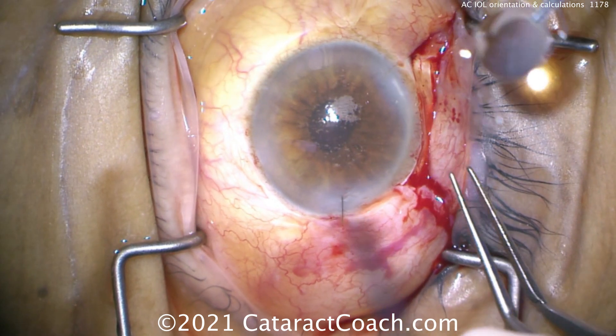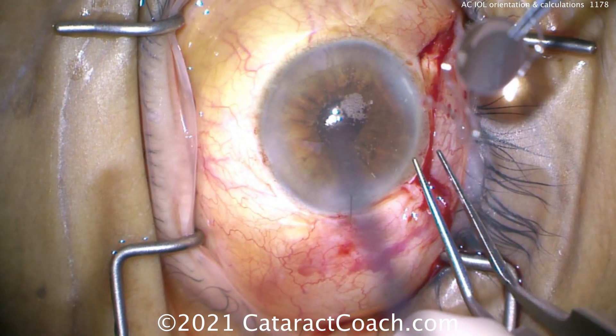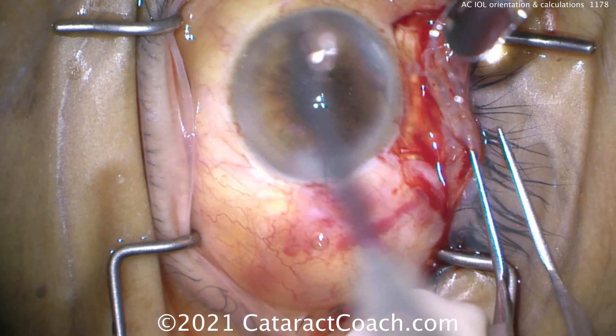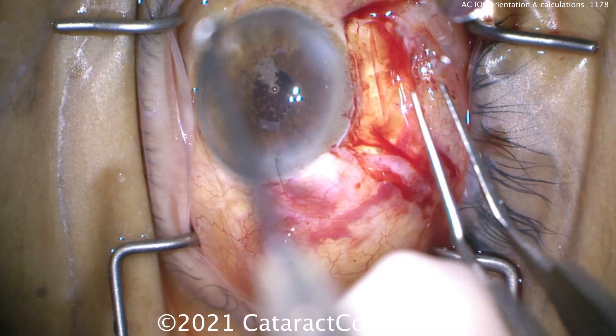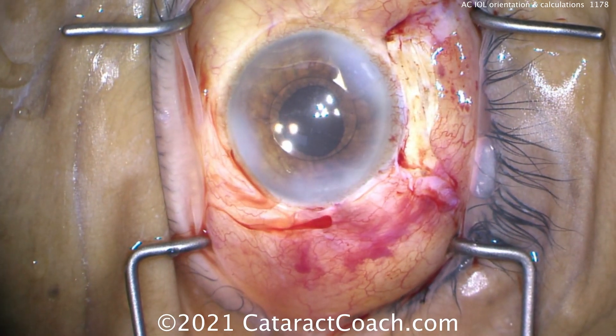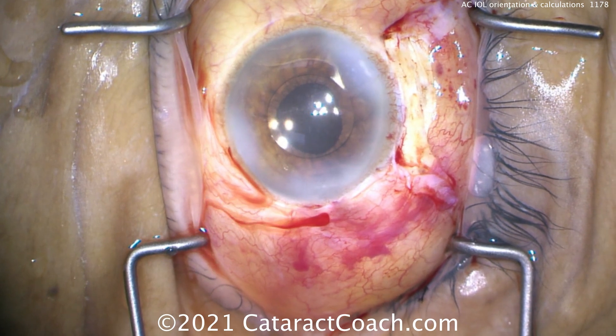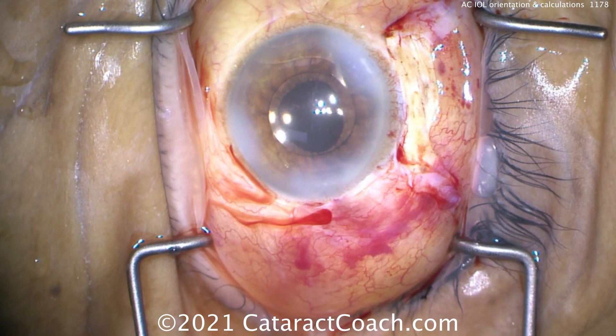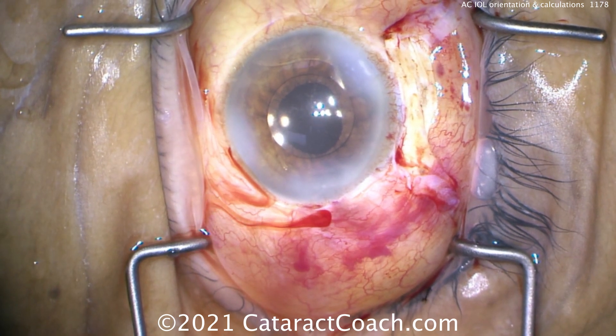You certainly also have to make a peripheral iridotomy in these patients, and that's easy to do — we've shown that in a previous video. In this case it's tucked under the arcus senilis, so you don't see it so well. There it is in the eye — there's the anterior chamber lens in good position. Notice the pupil: nicely placed behind the optic. And again, we have a peripheral iridotomy, so you're not worried about pupillary block here.